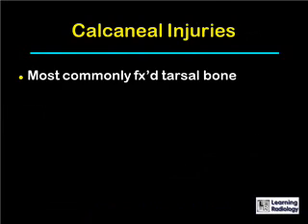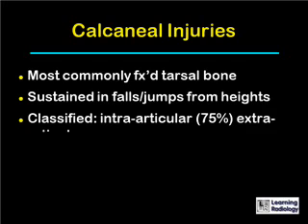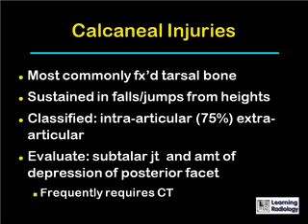Calcaneal injuries are the most commonly fractured tarsal bone. They're sustained usually in falls or jumps from a height. They can be classified as intra-articular, which comprises the vast majority, or extra-articular. It is important to evaluate involvement of the subtalar joint and the amount of depression of the posterior facet of the calcaneus, both of which usually require a CT scan.